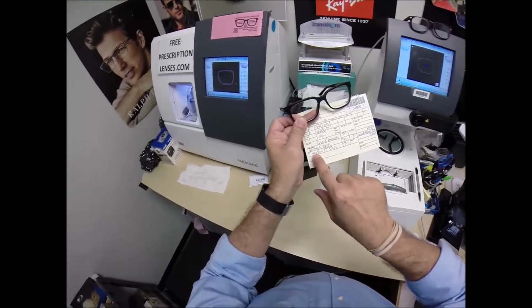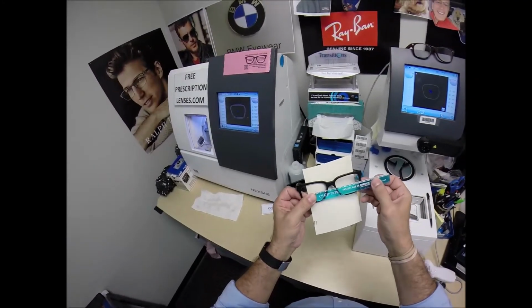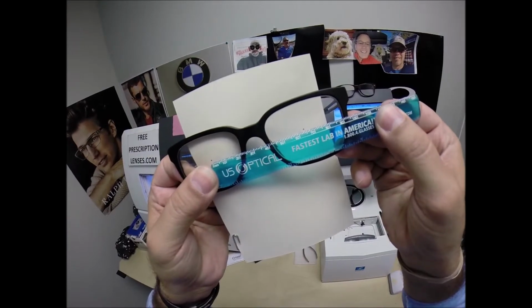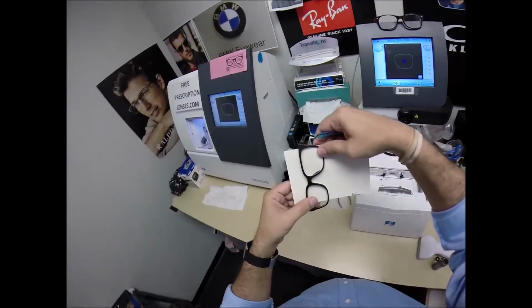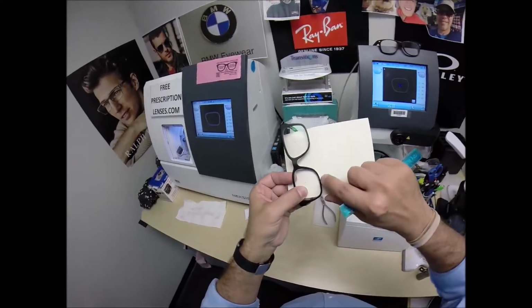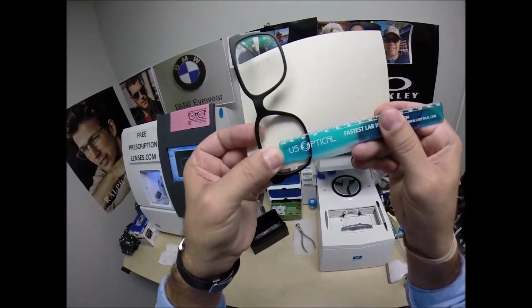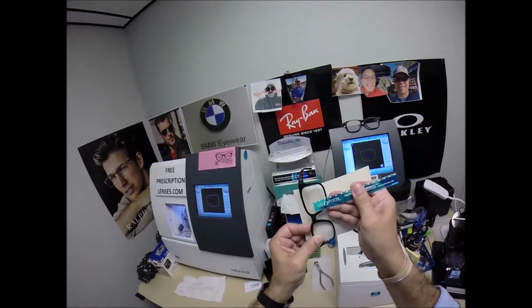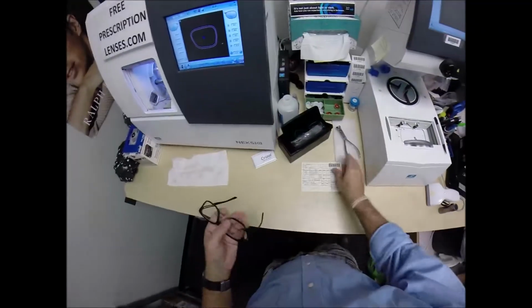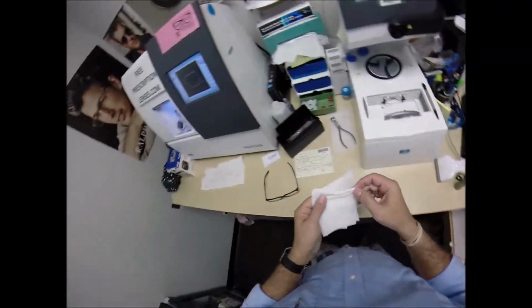Now your pupillary distance is 32 for each eye, which is a total of 64. I'm going to place the PD stick against my thumb on your right lens. When we hold it up to the left lens, we're getting 64 millimeters, so that is cut perfectly. We're going to check the optical center height of 22. Now don't look at the bottom of the lens, look at the middle of the bottom of the frame, and we're getting 22 millimeters, so that is cut perfectly. Man, I tell you, that guy with the bad jokes and the 40,000 edger, he really knows what he's doing.